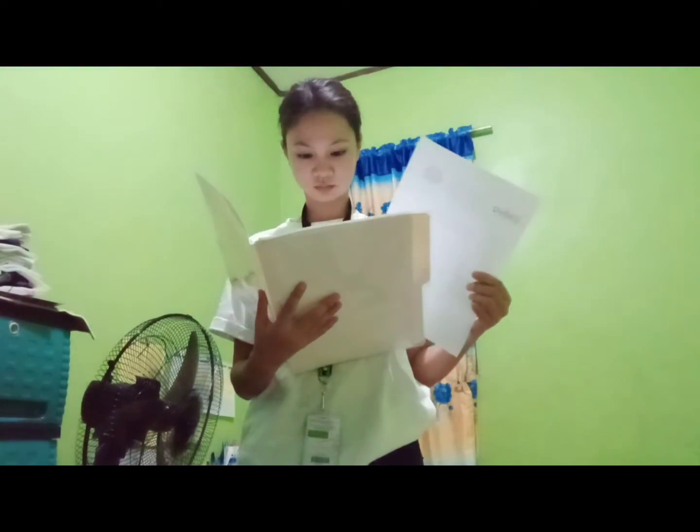Verify the physician order and identify the client to prevent potential errors. Wash your hands. Hand washing prevents transmission of microorganisms.